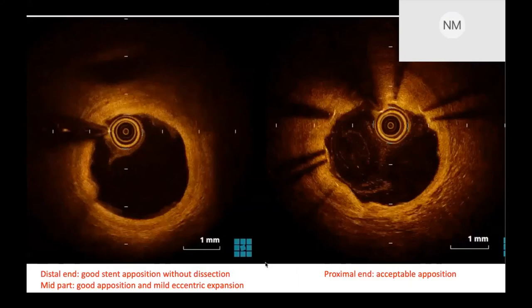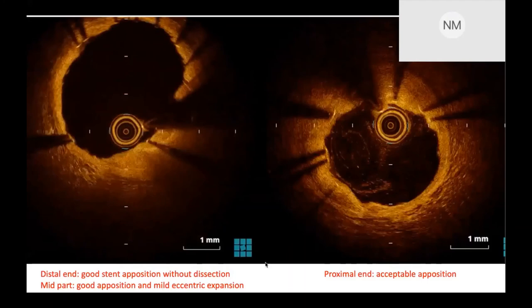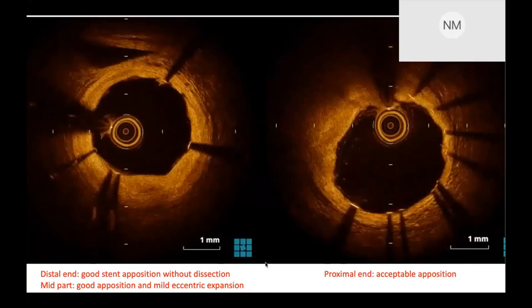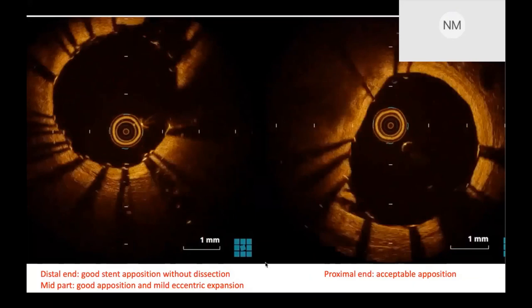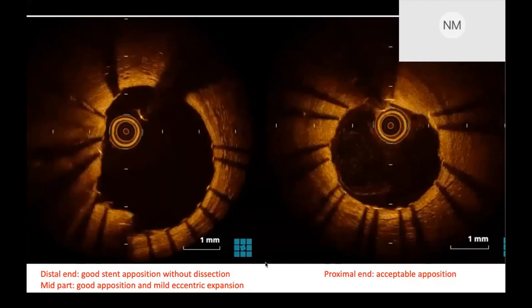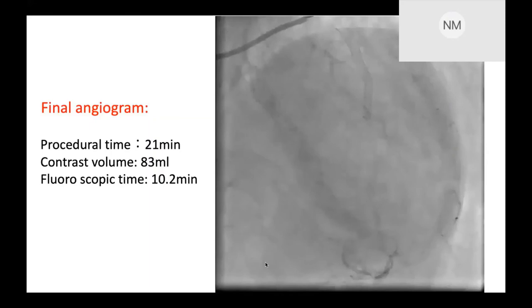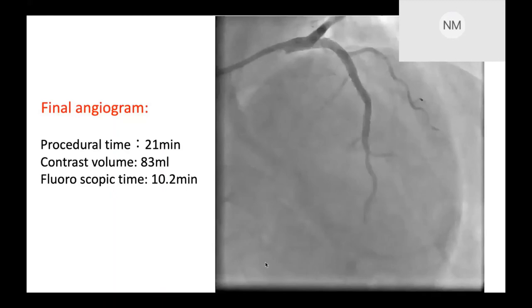This is the final finding. There is no dissection at the edge part of the stent, and I think the stent expansion is acceptable. Looking at the proximal end, there is acceptable stent apposition. This is my effort to simplify the OCT-PCI in Shonan Chemical General Hospital. Our final angiogram shows a good result, with a procedure time of around 21 minutes and contrast volume smaller than 100 mL.